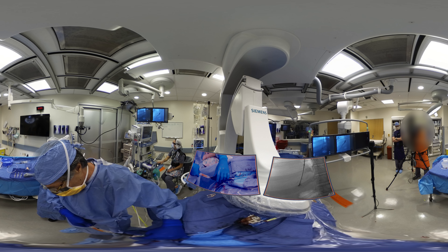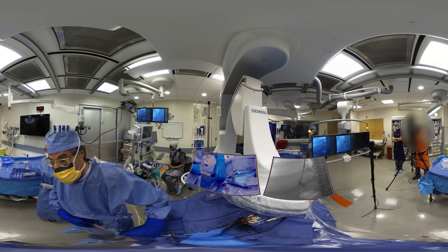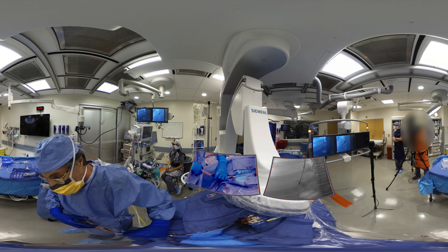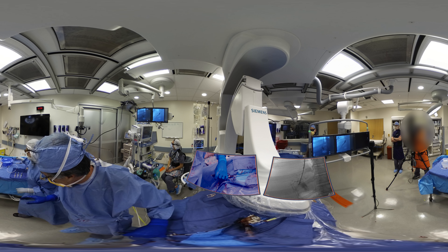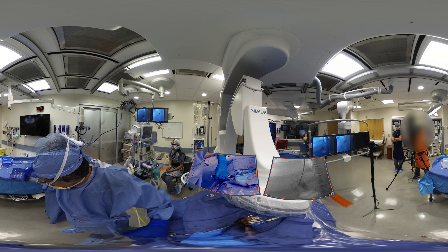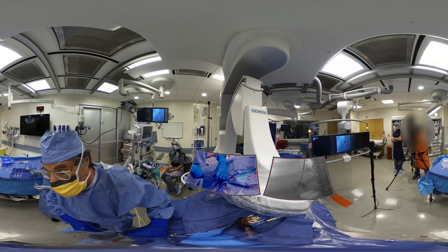I do want to keep in mind when I'm approaching the hepatic vein, because I don't want to skid back in the hepatic vein and land in the vena cava. We do want to make sure that we're in the liver. There are little tiny branches of portal vein that we're seeing on fluoroscopy, and there's a little bit of return there. Hand it off to the front hand and inject a little bit of contrast. We're seeing in the background some portal vein branches, but not a clear way down. We'll spend a moment on that with the wire, as unlikely as that is, on the small chance this might lead us somewhere, even though there really wasn't a clear path down.